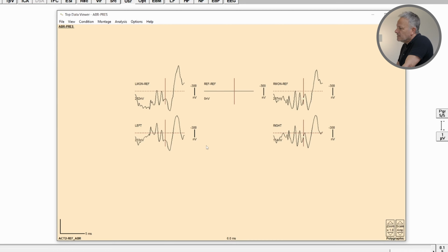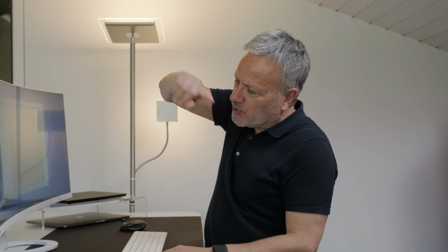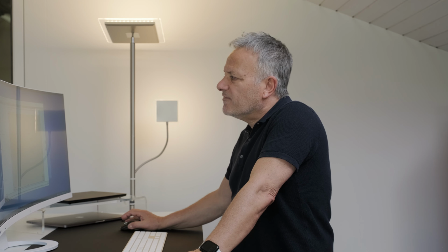But I think it's fair to say that what we've acquired is not really that bad using pretty bad earphones. As well, you can't see the stimulus artifact. You remember, using a TDH39 we had a wonderful downgoing, because it wasn't rarefaction, downgoing, upgoing, big stimulus artifact swinging out to about 1 millisecond. And then we were seeing waveform 1, 2, 3, 4, and 5 beautifully. Here it's not as simple to see as we would have anticipated.